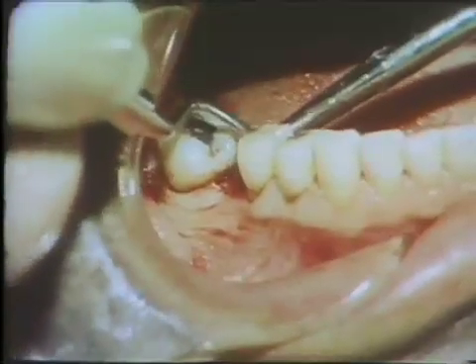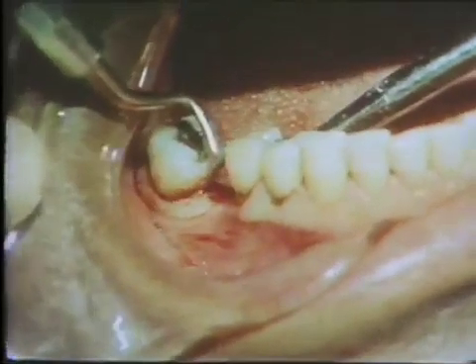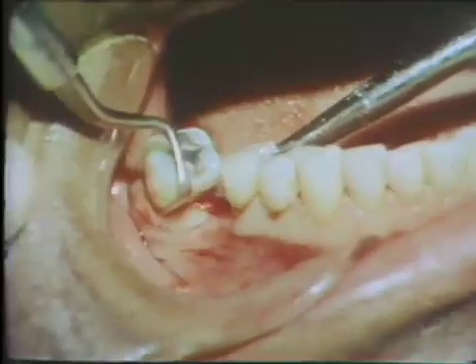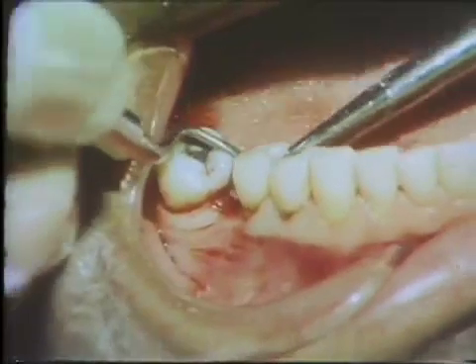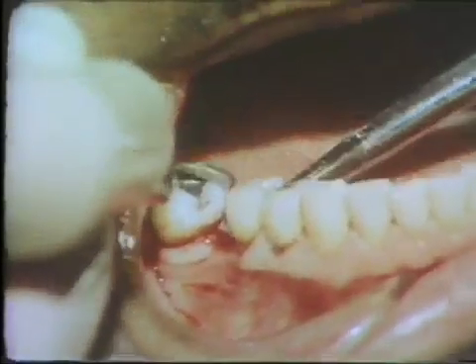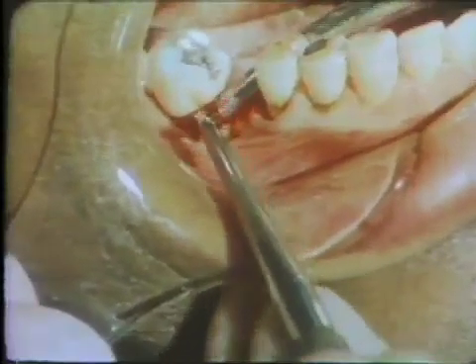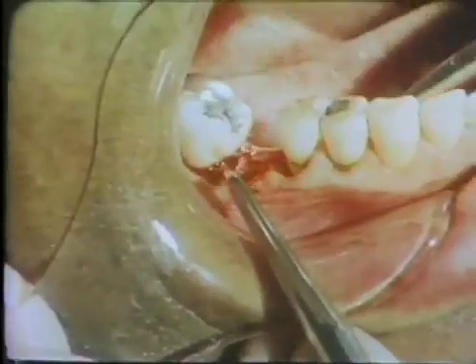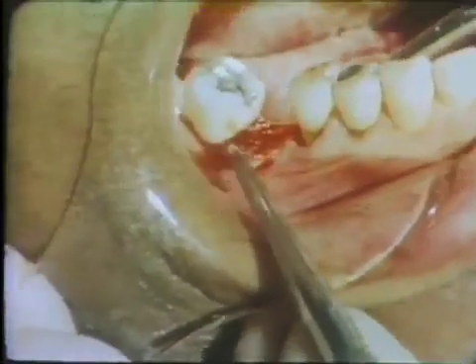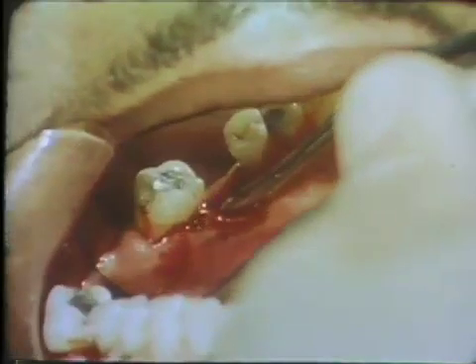Next, an intracrevicular incision is made with an Orban knife into the wall of the mesial pocket of the molar. This incision is extended to the bone in the angular defect. A buccal mucoperiosteal flap is raised with a Bennett elevator. A No. 7 wax instrument is used to raise the lingual mucoperiosteal flap.